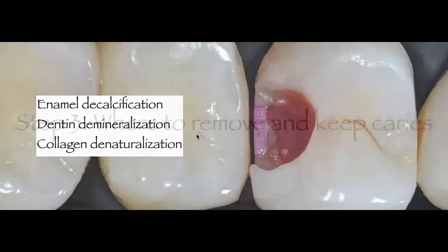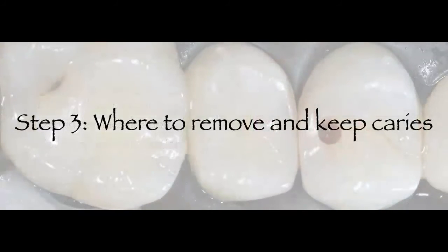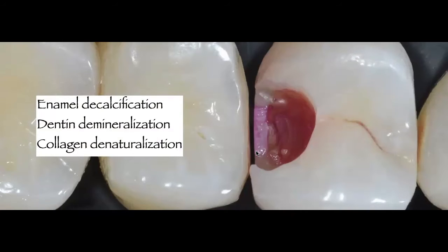But I go ahead, I'm sorry, let me go back once. Once I go ahead and I use my caries detection dye, you can see that there is still enamel decalcification present that is now stained by my caries detection dye. And this is after applying the caries detection dye, leaving it in contact with the tooth at least for 10 seconds, and then rinsing and drying. This is what you see.